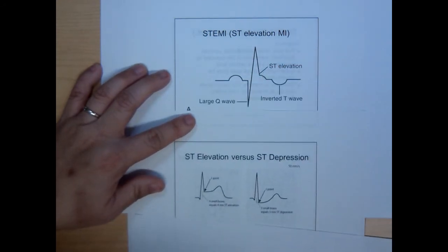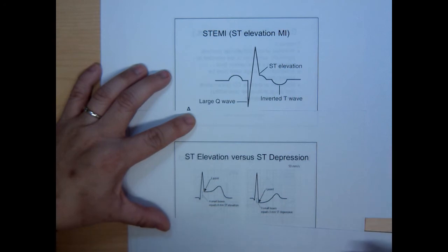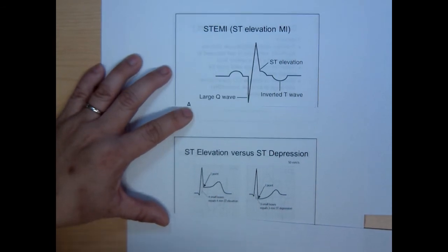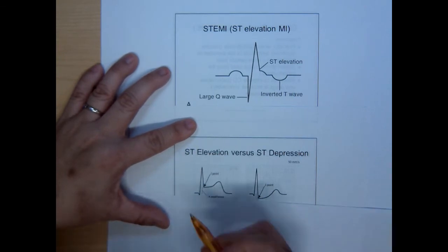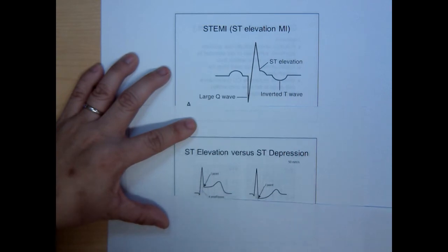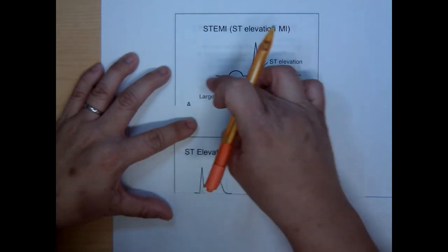Likewise, here's another picture for you. When you see ST depression, they talk about this J point reference, because you have to look at when the heart is about to completely relax, and what is happening as far as myocardial damage that's causing an ST elevation to show up on an EKG, or an ST depression. So again, where the PR is, that's where you look at your isoelectric line. Just imagine going across from PR to QRST.